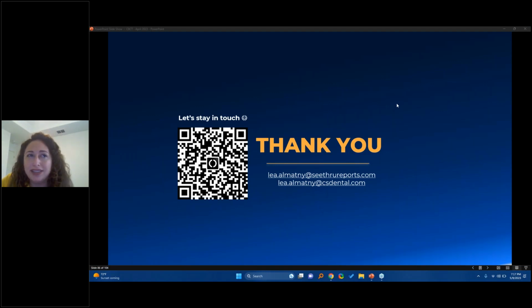But like a didactic course, as a beginner, I think it would be best to learn the software first and master that, because any full day CE course I would recommend can be more overwhelming, and you leave with too much information, not sure where to start from. So in the beginning, learn the basics of your software, and the YouTube channel that I just shared helps a lot with that.